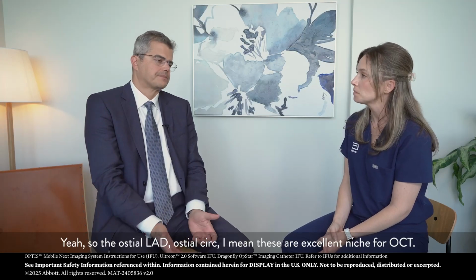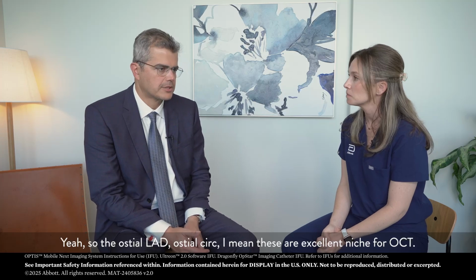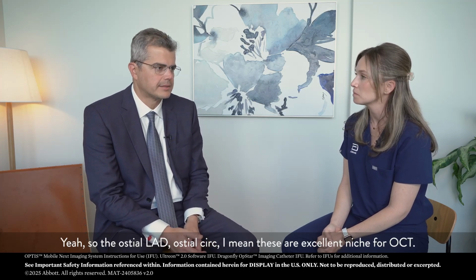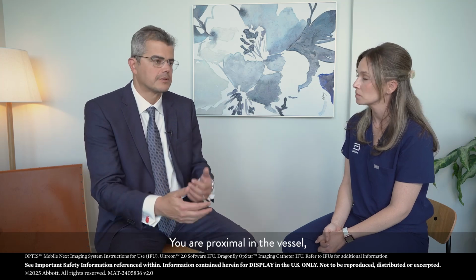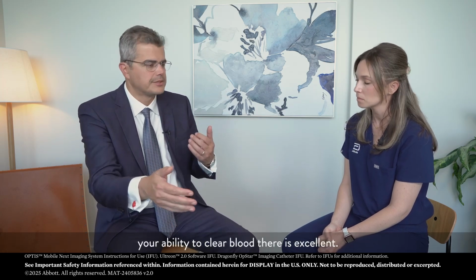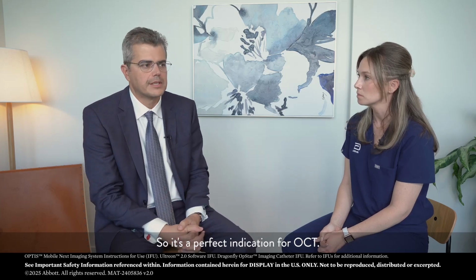Yeah, so ostial LAD, ostial circ, I mean, these are an excellent niche for OCT. You are proximal in the vessel. Your ability to clear blood there is excellent, so it's a perfect indication for OCT.